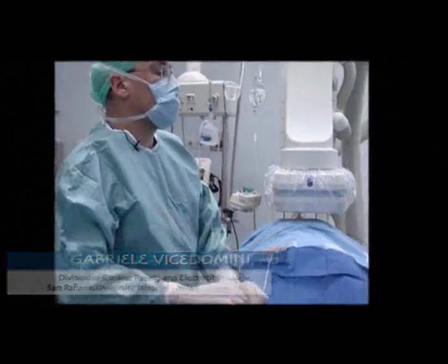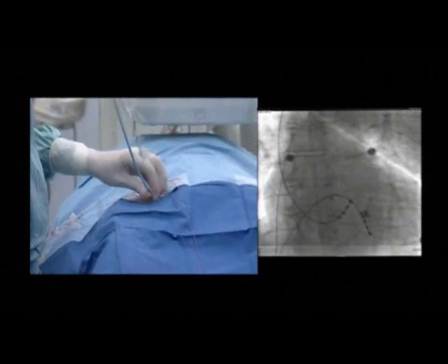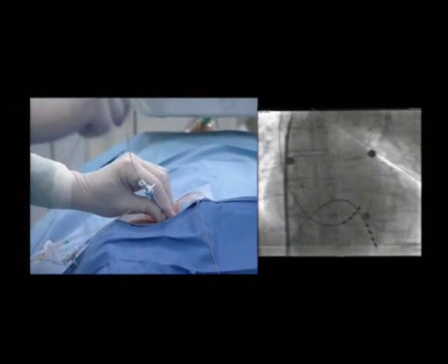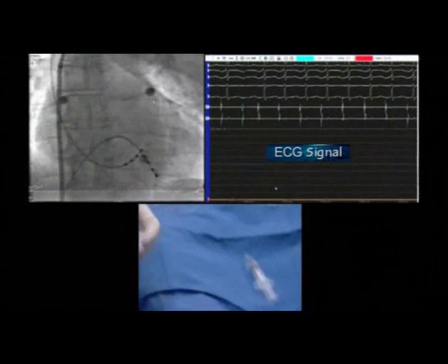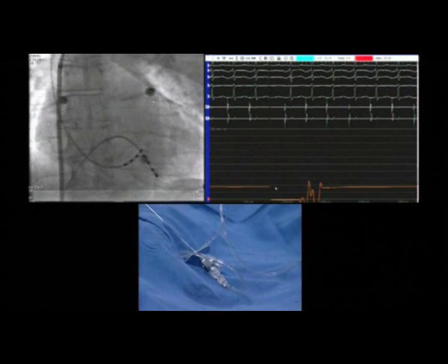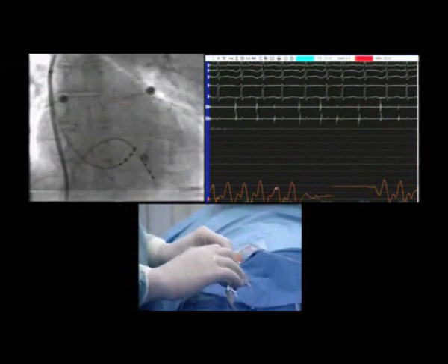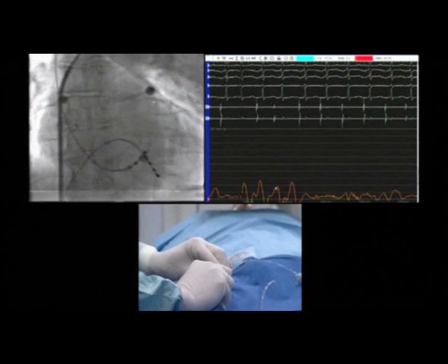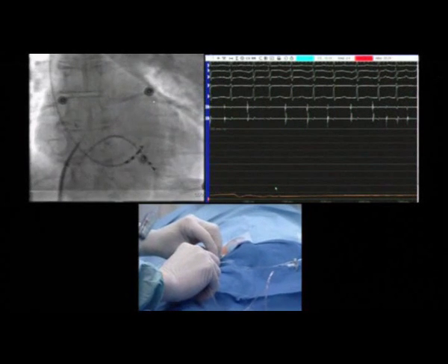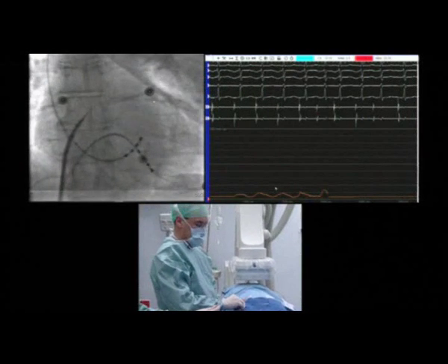We now do the transseptal puncture with a standard procedure. This is a rather stiff catheter, so we must allow some freedom of movement. The needle, connected to a pressure line, is inserted inside the sheath and pushed upward towards the superior vena cava until it reaches the tip of the sheath. Both are then dragged down very slowly into the right atrium until a jump is felt. At this point, the operator pushes the tip of the needle just outside the tip of the sheath and, most importantly, rotates it 45 degrees backwards to avoid aortic puncture.